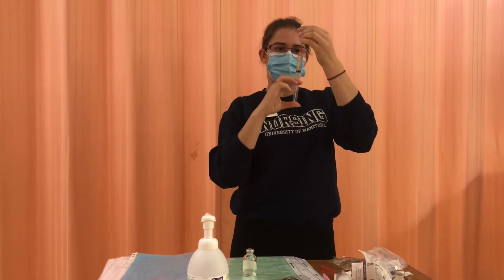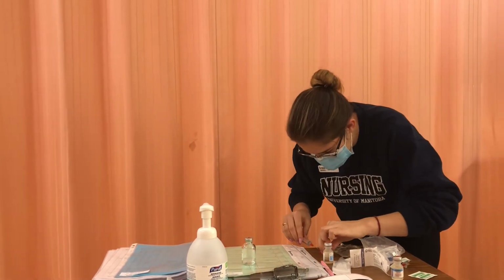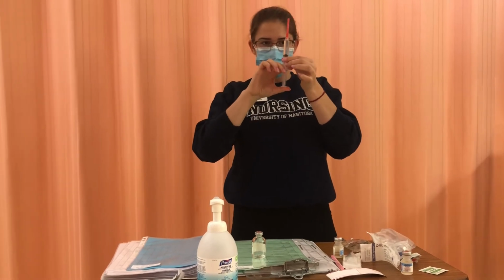And I'm pulling out just a little bit extra just to be able to tap out the bubbles. Okay, so I'm just going to use the swoop and scoop method to recap so I can tap out my bubbles. And I'm going to pull back and redo.